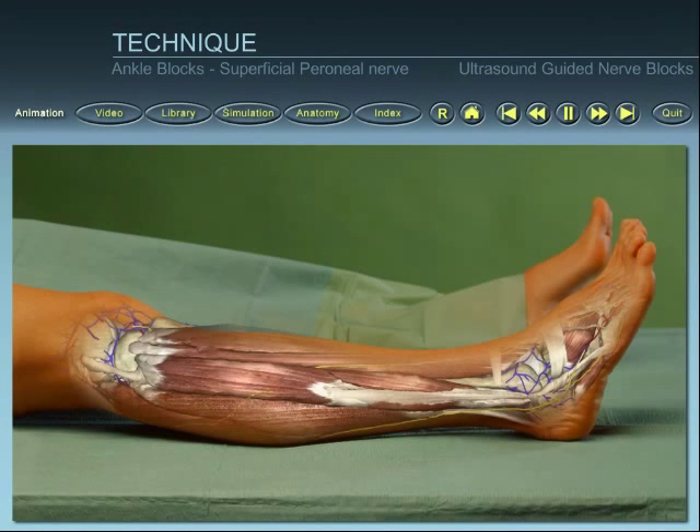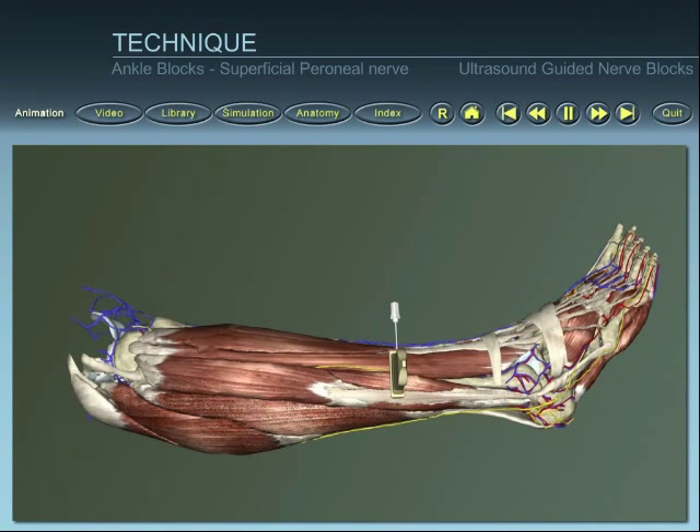Position the patient and identify superficial landmarks. Place the ultrasound probe on the skin.